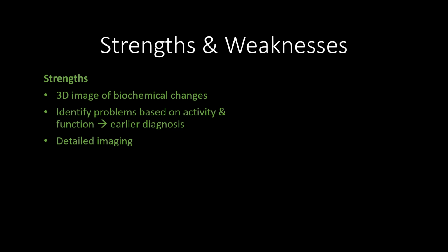and also more detailed imaging of other conditions. There is little risk involved with the intravenous administration of the radioactive tracer, as the tracer has a short decay time of only a few hours and is quickly removed from the body. Compared to fMRI, PET has a lower temporal and spatial resolution, but it is better at measuring physiological processes and is therefore a more direct measure.